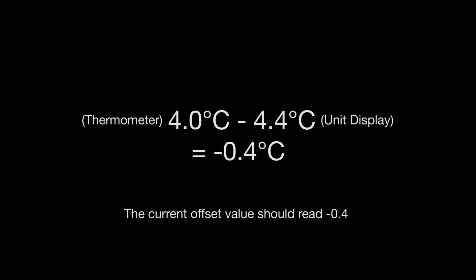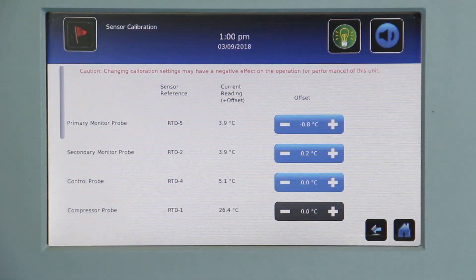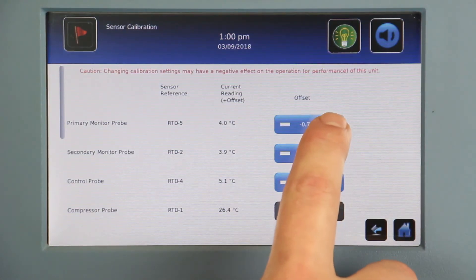To adjust the offset value, calculate the difference of the temperature on the display from the independent thermometer in the same probe bottle. For example, if the independent thermometer reads 4.0 and the temperature display reads 4.4, this is a difference of negative 0.4 degrees, and we would decrease the current offset value by 0.4. Touch minus or plus on the corresponding spin box to increase or decrease the value by the difference.